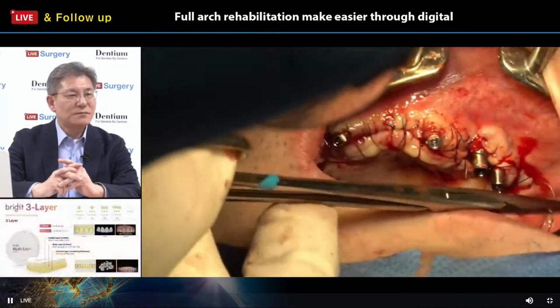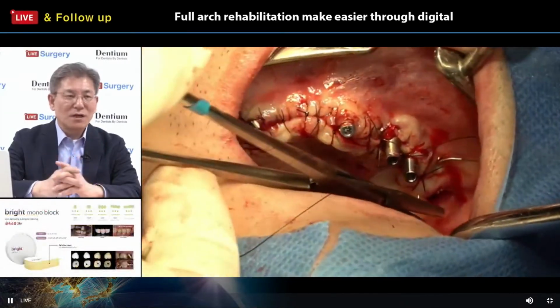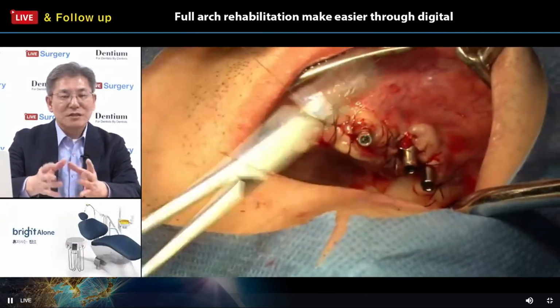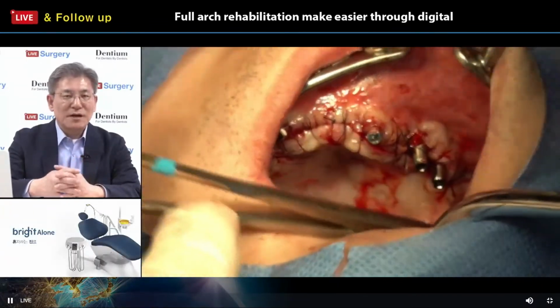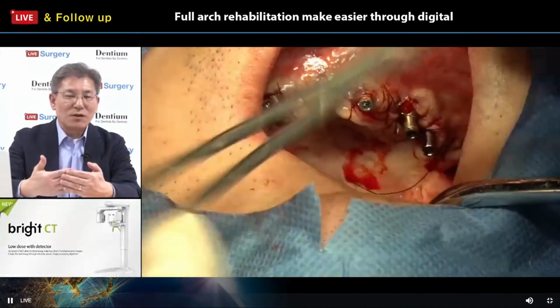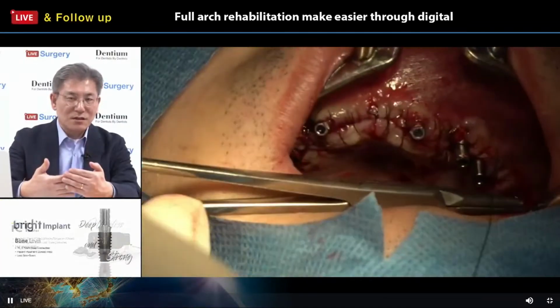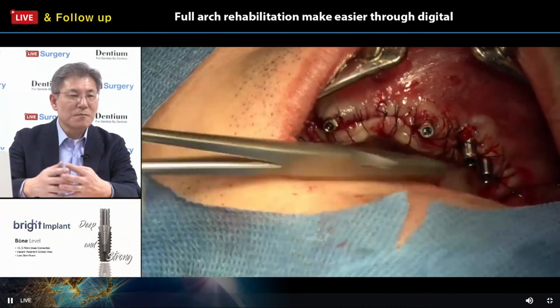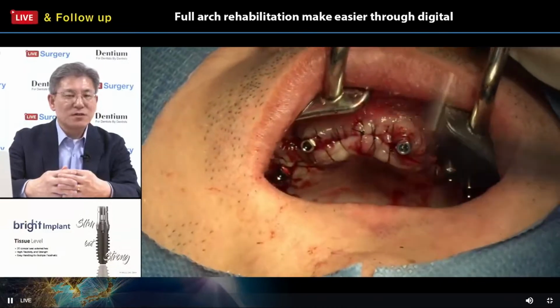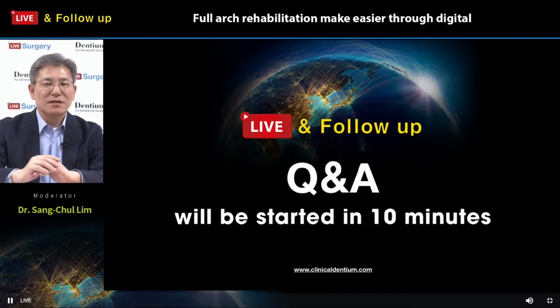Okay. Yeah, the collagenized bone is a very versatile and useful bone grafting material. It comes in another shape of graft material, so this one is easy to mold and easy to apply, like in the sinus area. And also today's surgery showed us the double layer of xenograft and alloplast.